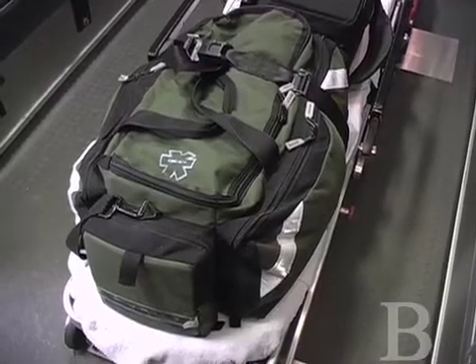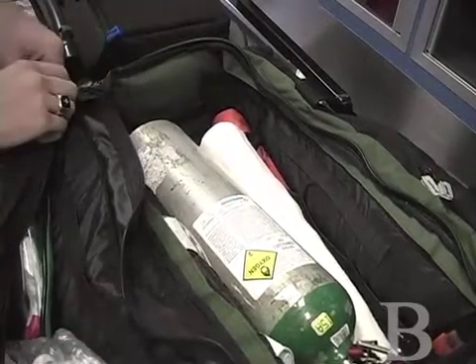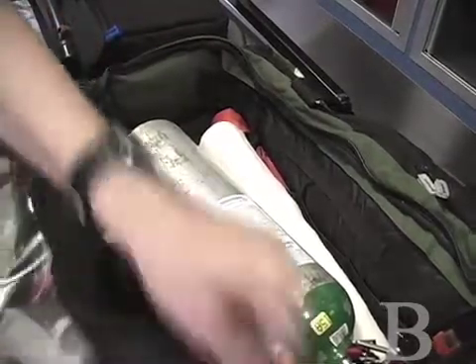In here, we have our oxygen tank, which we can use to provide oxygen to our patients if needed. Pretty much this entire bag is just dedicated to keeping the patient breathing.